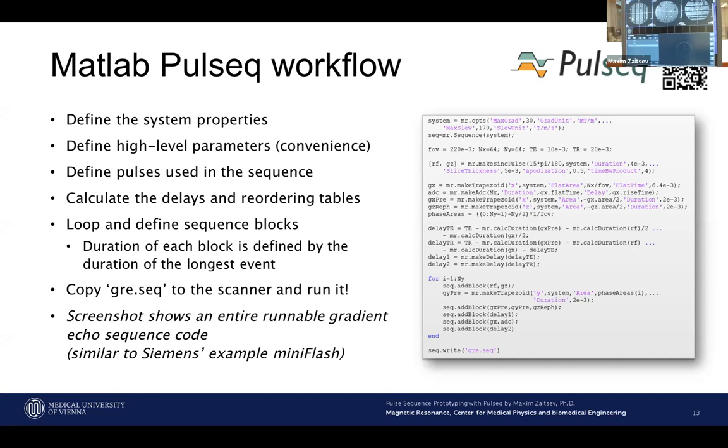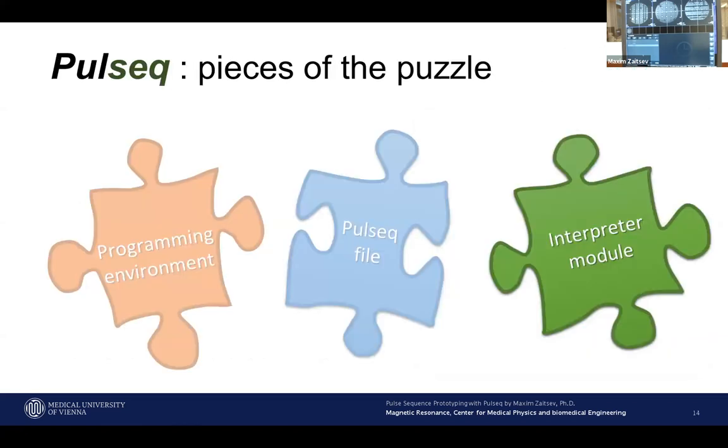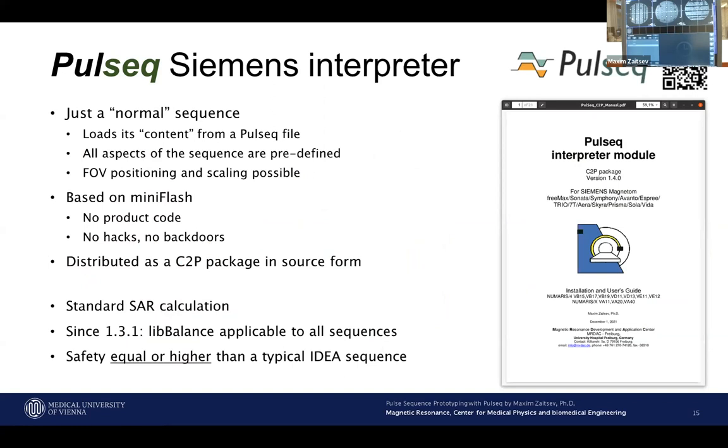And like I said, the screenshot is really a complete sequence which is comparable to the Siemens example mini flash in the initial state. But to run it on the scanner, we need an interpreter module, a module which will read in this .seq file and convert it into the hardware-specific instructions. That's basically what it does. It's just a normal pulse sequence.